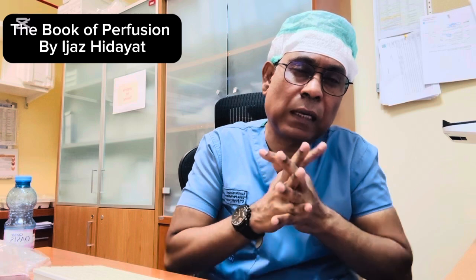So today, as I mentioned, the objectives are the preparation of the ECPR kit, equipment and disposables, manpower, and the scenarios and activations. So let's talk. For preparation of ECPR, we have the ECMO trolley with the ECPR kit, and we always keep primed machines. We don't want to lose even a second priming the circuit, so we always keep a primed circuit ready, because the life of a primed circuit is 1 month. So 30 days is enough for the priming of your circuit.